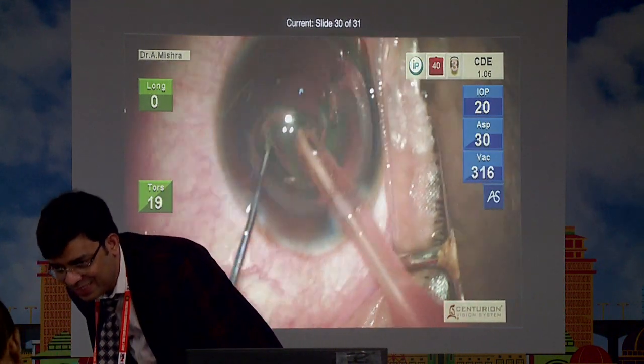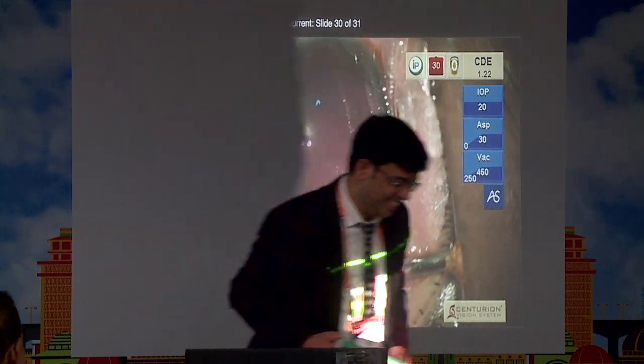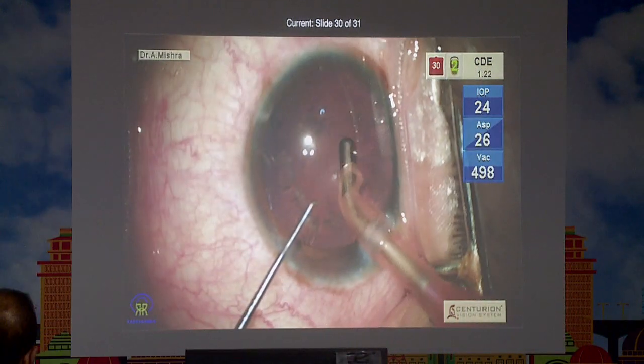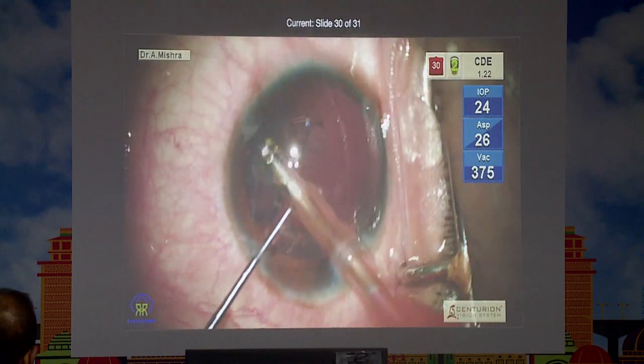So on an average, this is what it takes, the volume of fluid for one surgery. So we are reduced down to 30. So with the 10 milliliters of fluid, we manage the whole nucleus, epinucleus management. We're still left with 30, and we initiate the cortex management now.